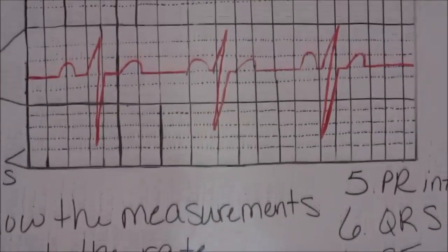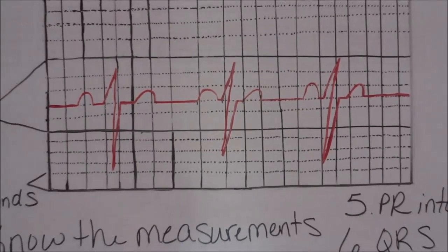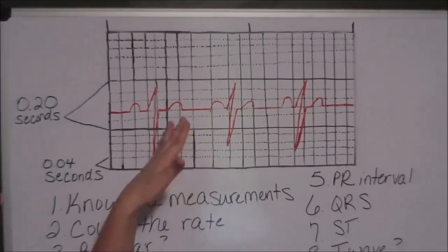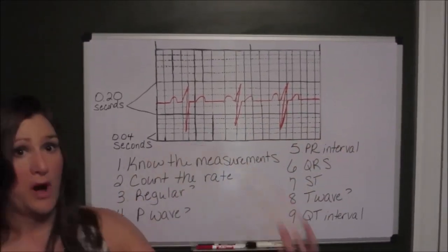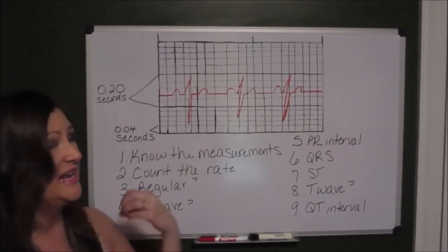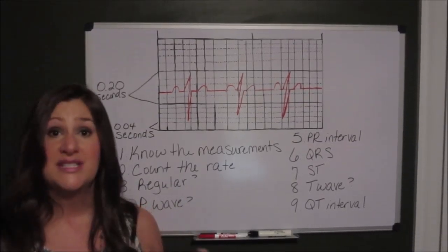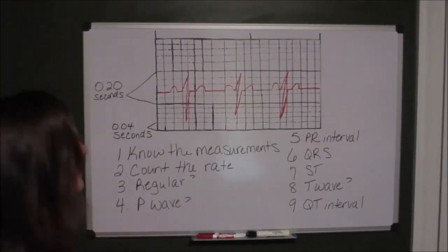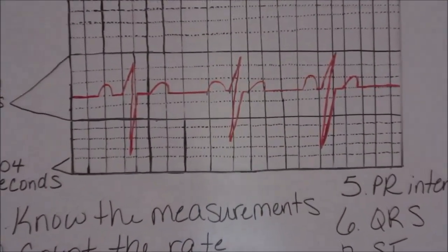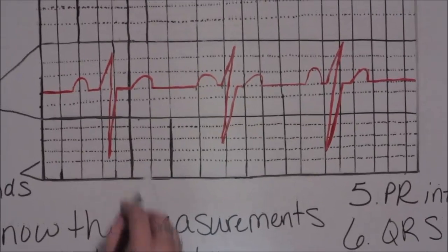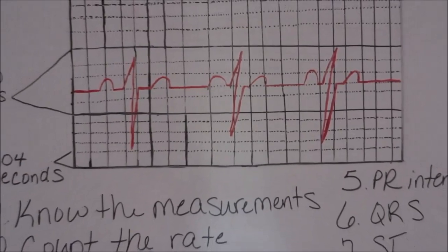The next thing we're going to look at is the T wave itself. Just like with the P wave, we want to make sure that there is a T wave for every complex, that it's upright. Because what we call an inverted T wave is going to indicate some ischemia going on with your patient. For this patient who is in a sinus bradycardia, there is a T wave for every complex and it is upright. So he's good.